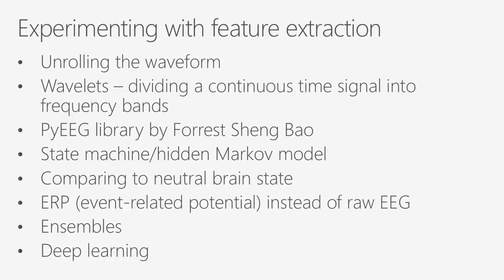One thing you can do is unroll the waveform, where I have all this data here, and take each of those 14 values and separate them out, and then the next 14 in the next millisecond, and make a whole thing, almost unrolling that.